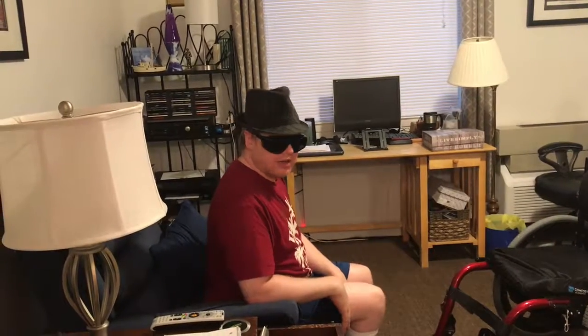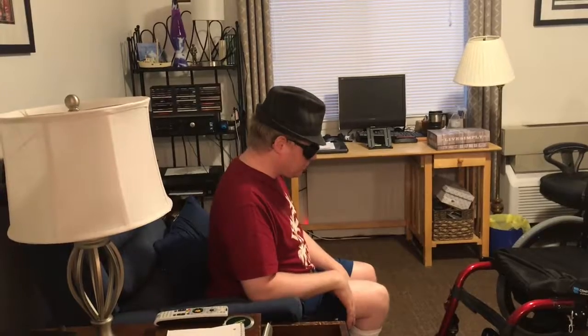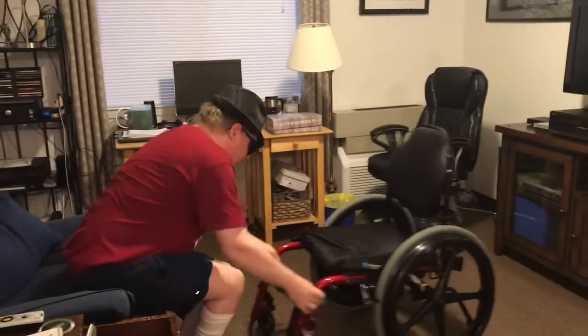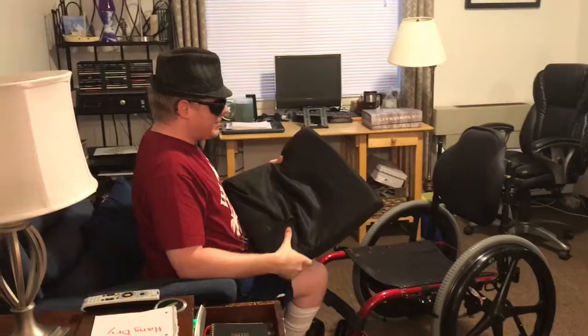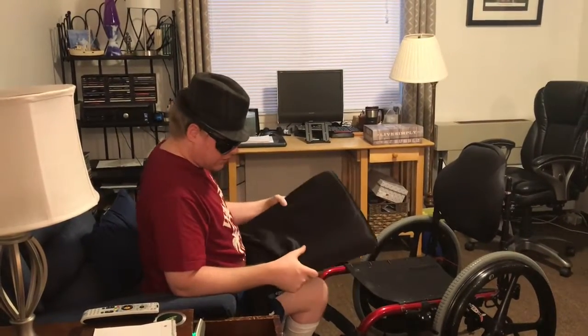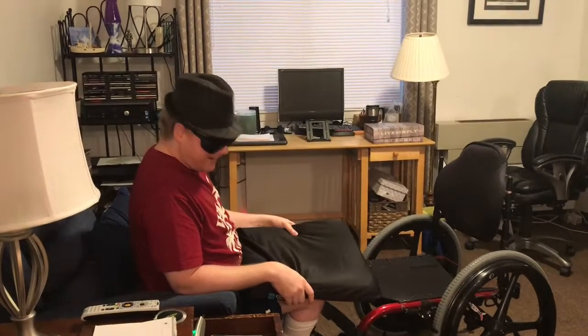Hello viewers, today we are working on trying to clean your wheelchair cushion. Why do we want to do this? Well, it's pretty obvious — if you are constantly sitting in it and you don't walk on crutches or anything, or even as just a general rule, it's gonna stink after a while.